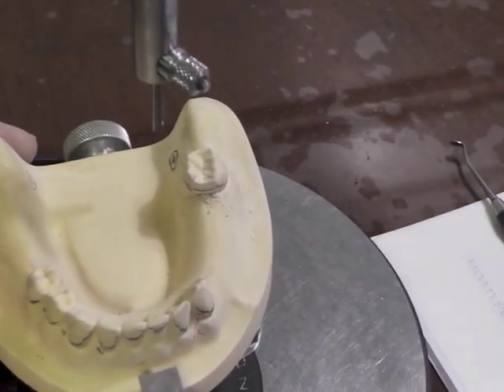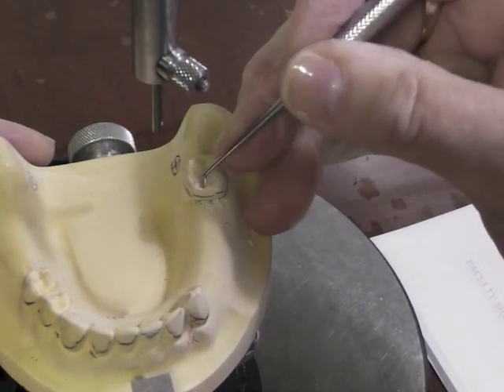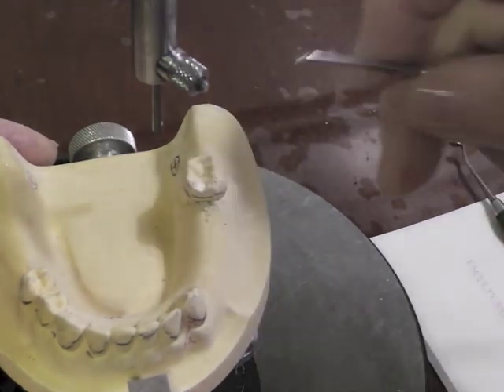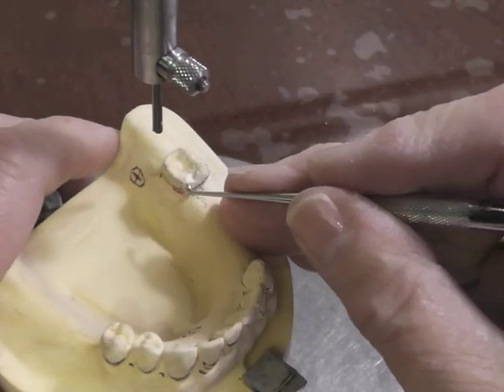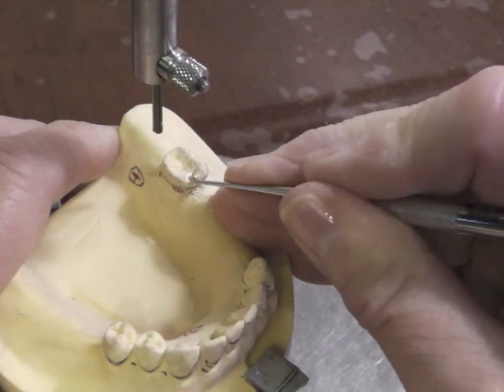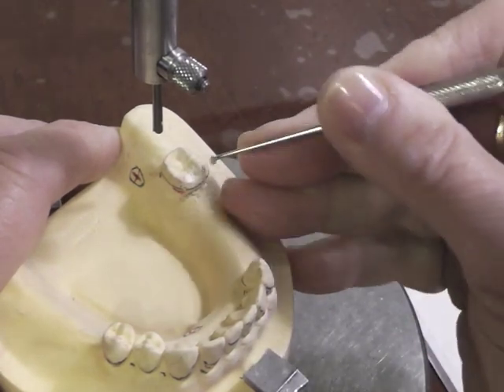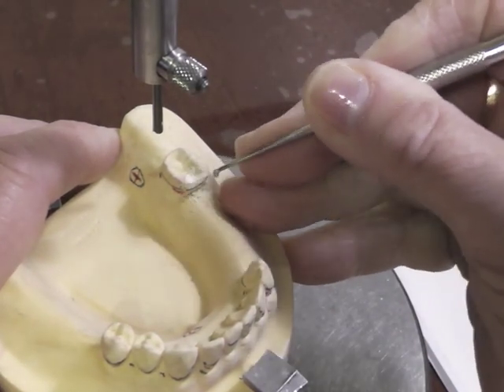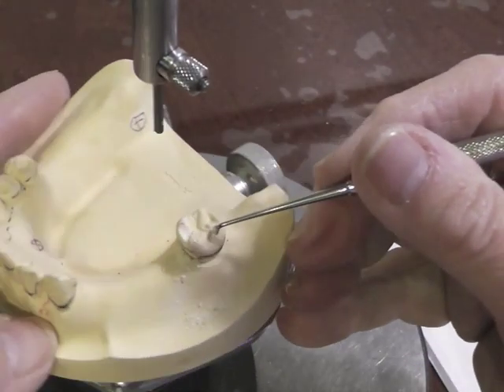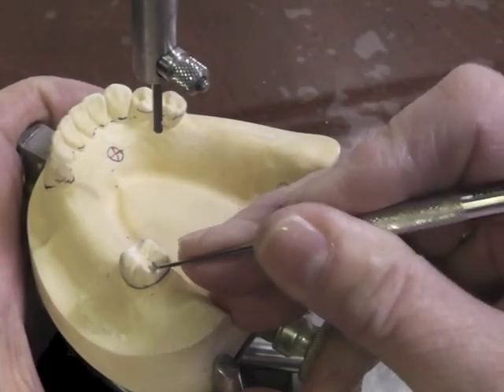The reason I prepared the guide plane first is that now I'm going to prepare my rest, and if I had to take it into the depth of my fossa, I would have to kind of start over on my rest. You would remove around a millimeter to a millimeter and a half of the marginal ridge. This is a ring clasp so it's going to go around in this direction to the buccal. So I'm preparing a little sluice way here. My reciprocal component will be on that side, so I'm also going to have a distal rest.